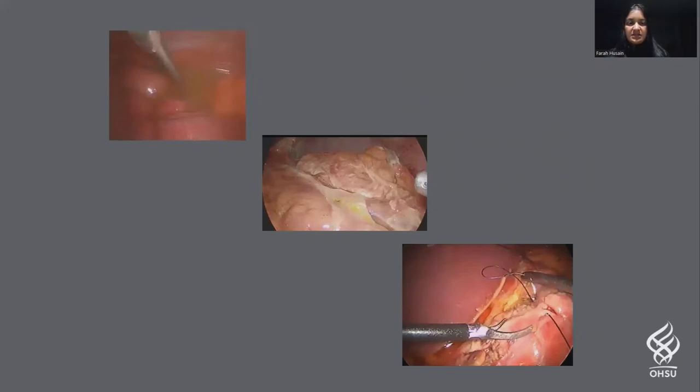So in these cases of a perforation of a marginal ulcer, much like a leak, you'll see this murky fluid in the abdomen that you have to wash out as much as possible. Often if it's been a day or more of this exposure, they'll have this fibrinous exudate on their tissue. The tissue just is a little tougher to work with and more inflamed.